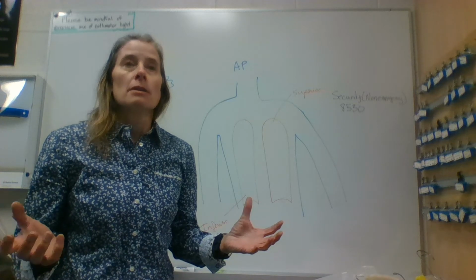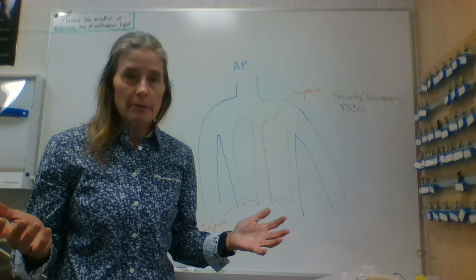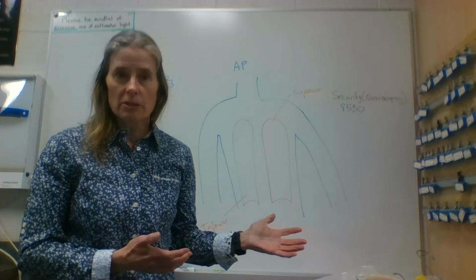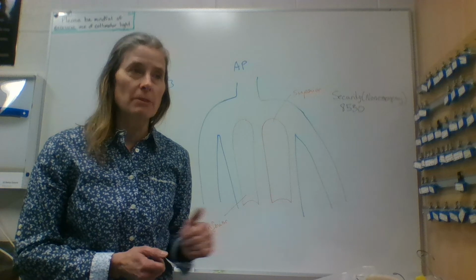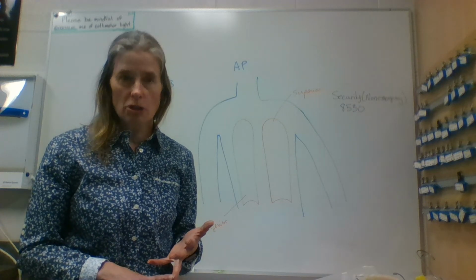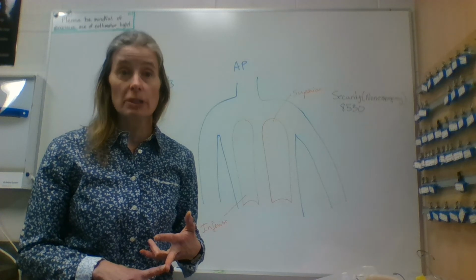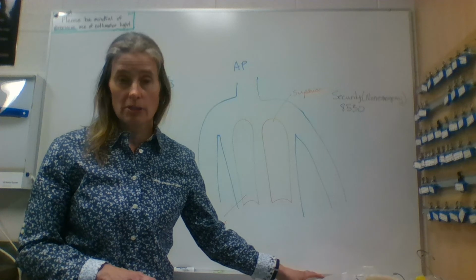It happens. The point is not how it happened, we're trying to fix it. So it might be something where we have to phone over to Emerge, or call the unit or have the DI nurse have a look at it. But you should not hear this chest tube system because it's a closed system.